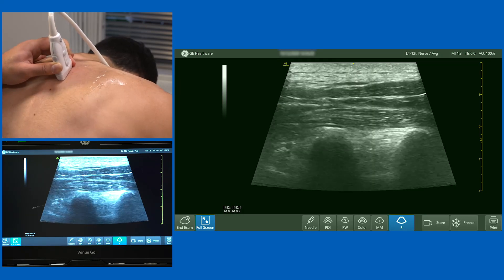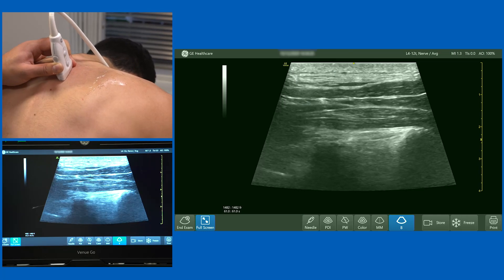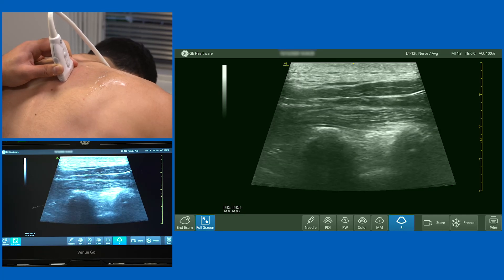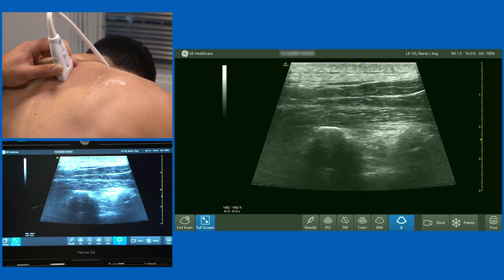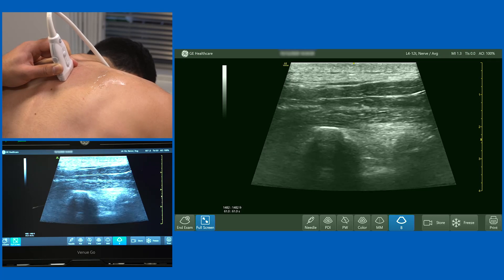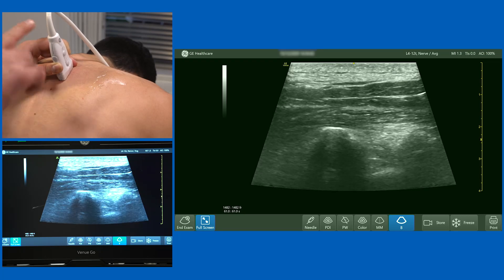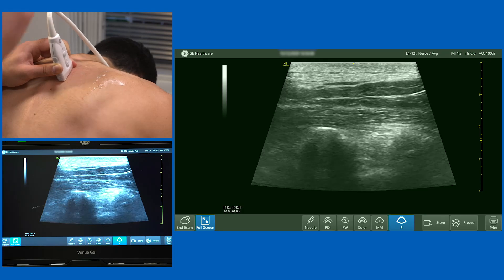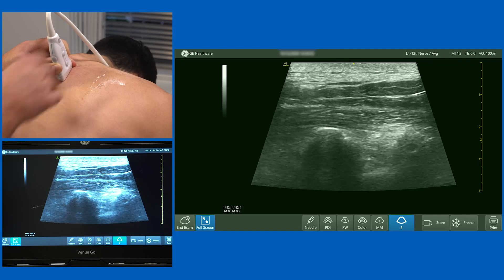The idea is to deposit local anaesthetic just between the erector spinae muscle and the fascia below it, just above the transverse processes. If you look carefully at the lower aspect of the screen, around the three to three and three-quarter centimeter level, you can just see the pleura glistening. One mechanism of action of the erector spinae plane block is that local anaesthetic deposited on that surface above the transverse processes may traverse the thick fascia and penetrate into the paravertebral space.